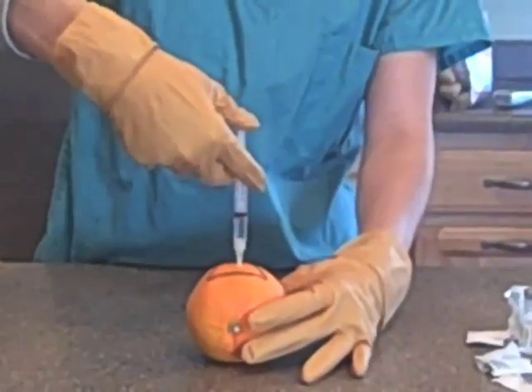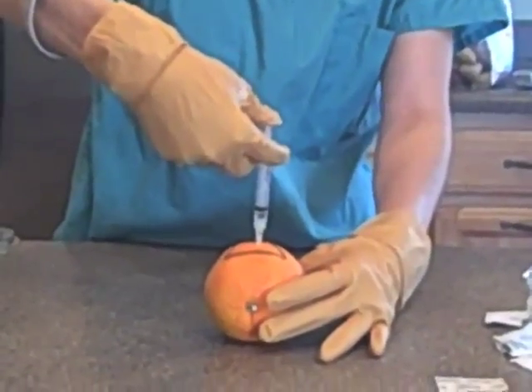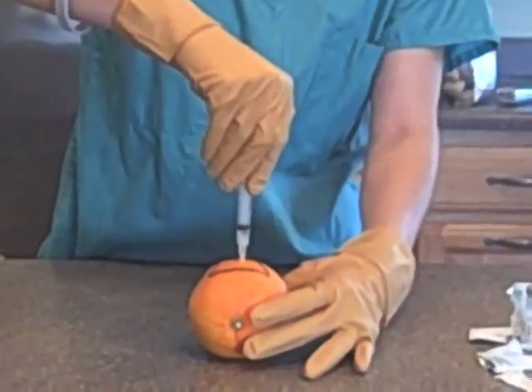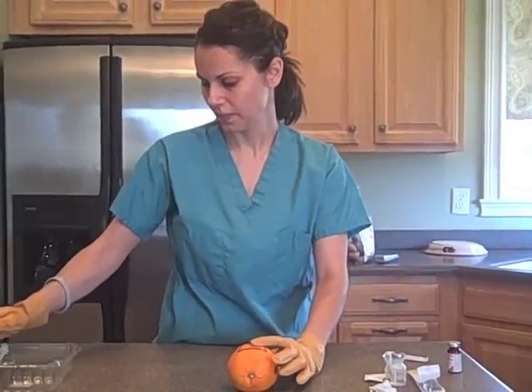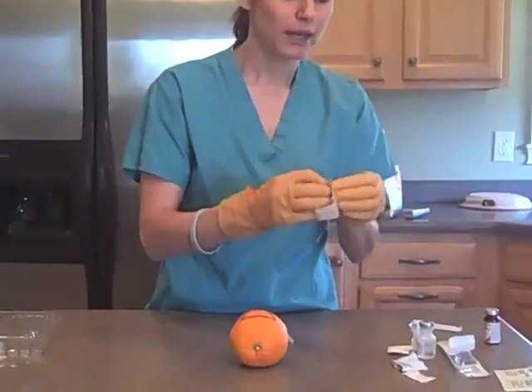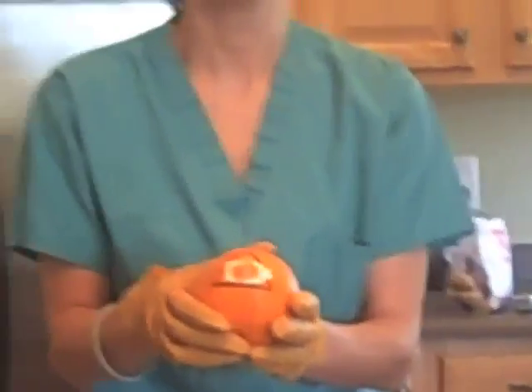Once we are in and we determine that we have not hit a small vessel, we slowly administer the vaccine and we pull out at the same angle that the needle was placed. We make sure we always appropriately put the needle away and discard it. Then we apply the Band-Aid to the site. And that ends my tutorial on how to give a vaccine.